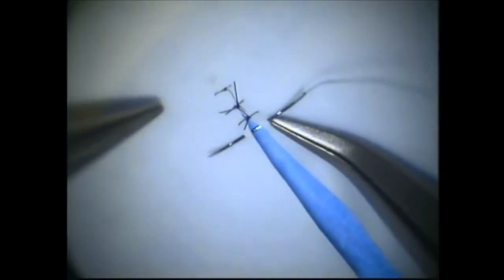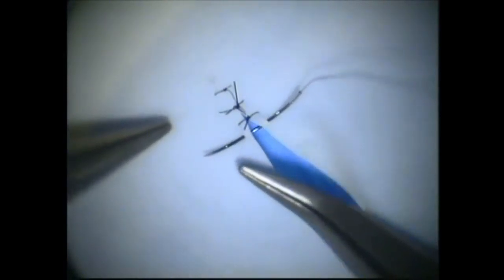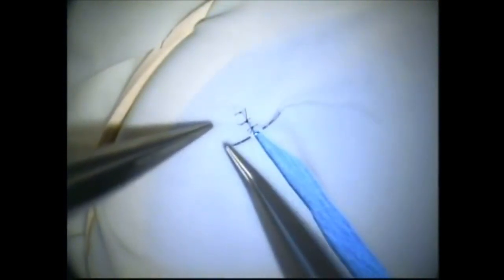Notice that this side may be a little wider than the other side — you should try to make both sides about equal distance from the edge in terms of the bite. Now let's zoom out and look at how we retrieve the needle. Grasp it from the edge but don't grab the very tip, or you can damage the fine point on the microneedle. Grasp it and gently supinate — turn your hand palm up — as you rotate it, using the curve of the needle so that we don't tear the tissue.